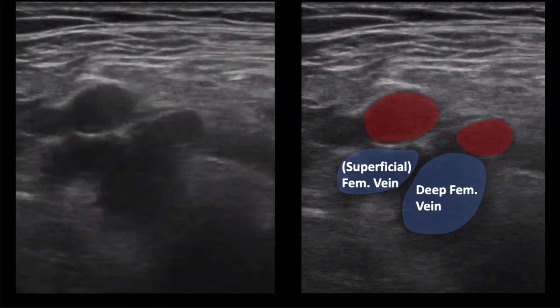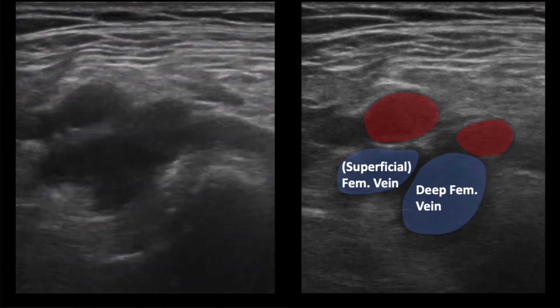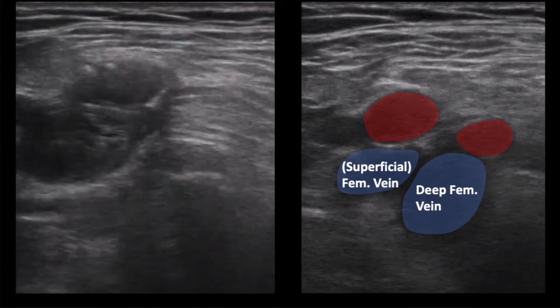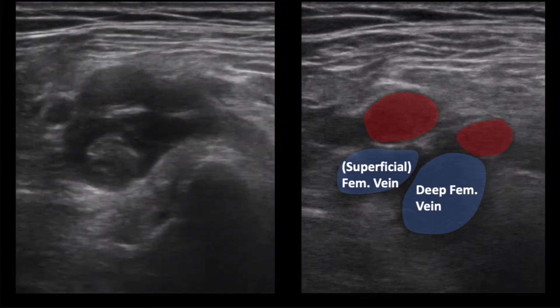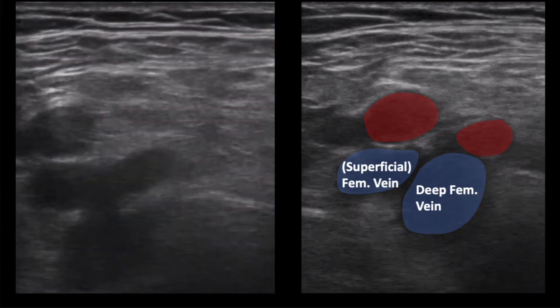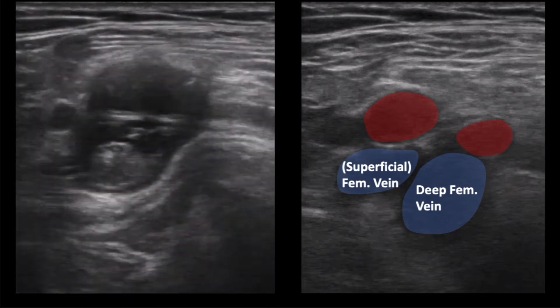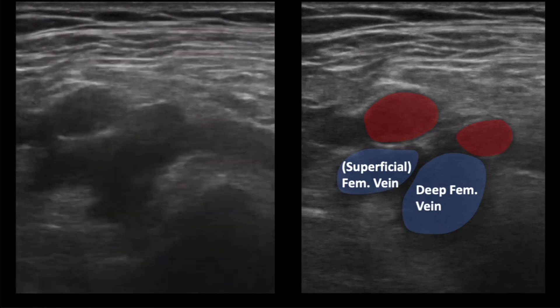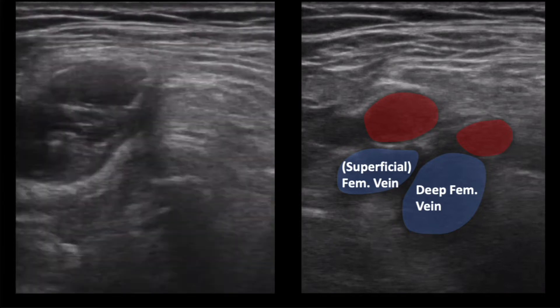I personally find this the most challenging view to obtain compared to visualization of the common femoral or popliteal. The deep femoral vein tends to quickly dive deep, making it difficult to visualize and compress. Additionally, the bifurcation is not the easiest to identify and compress in some patients. In this patient, the echogenic clot can be identified in this clip, and while not captured, the femoral vein was not completely compressible.